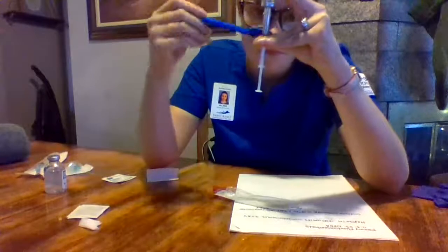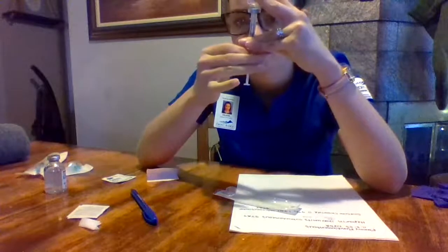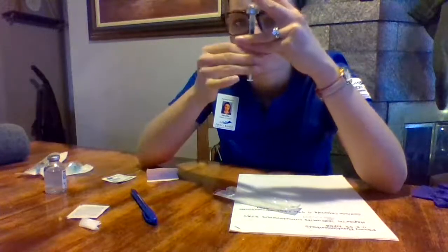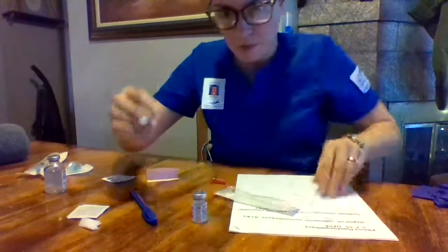To get rid of all of my air bubbles. Recap my syringe.